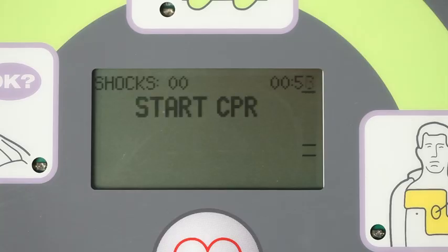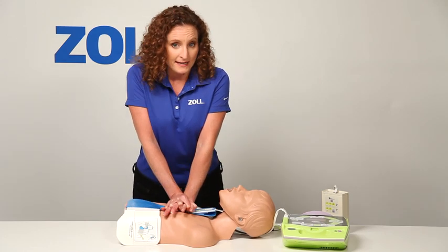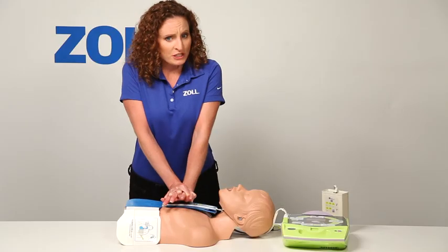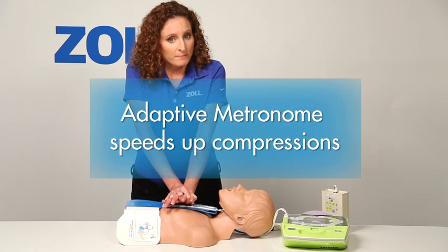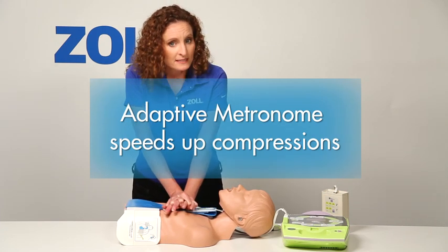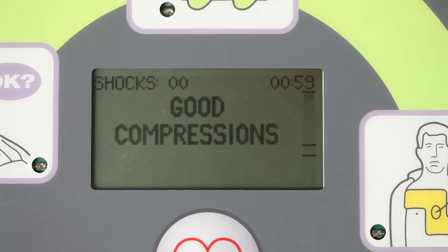When I do start CPR, it will see my chest compressions and will help me do good CPR in a way that no other AED can. Notice the bar gauge on the display as I start chest compressions. Push harder — I'm not pushing hard enough. The beeps act as an adaptive metronome that monitors my compressions. Good compressions.